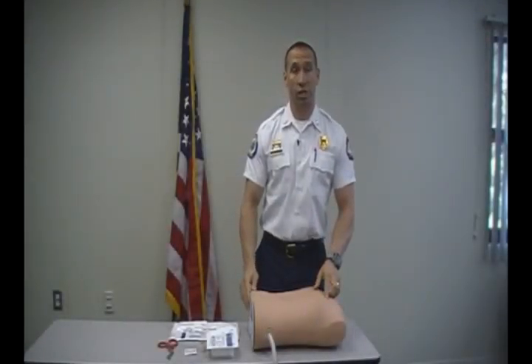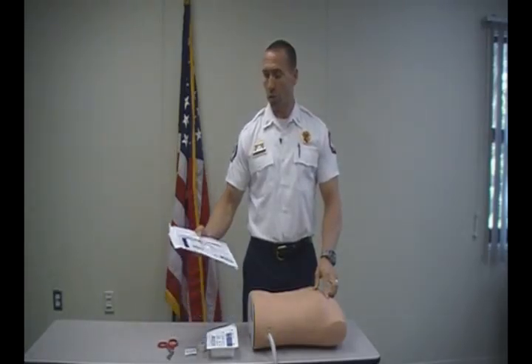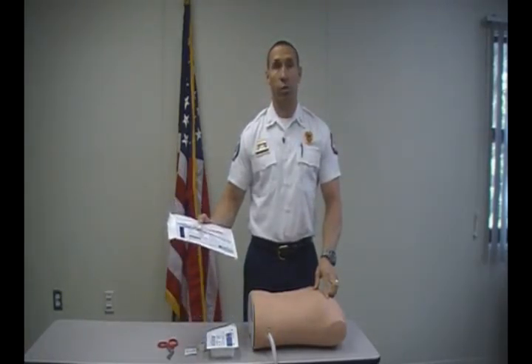Today we're going to cover the procedure for doing a chest decompression using the Turkle Safety Fluid Drainage System. Here's the equipment that you'll need.